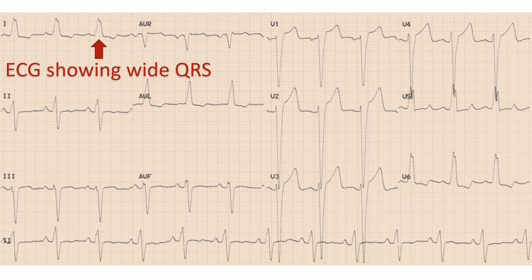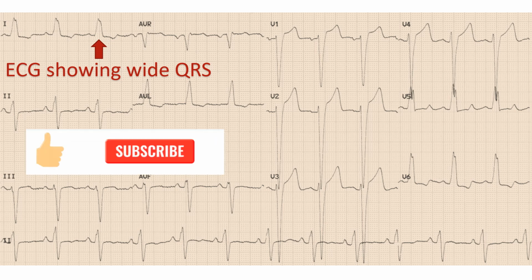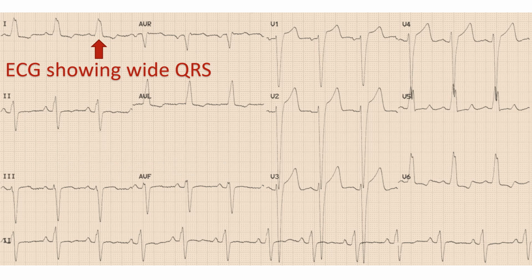In some persons with heart failure and reduced ejection fraction, contraction of different parts of the left ventricle loses its natural synchrony, so that part of the contractile effort is wasted. This can be inferred from ECG, the electrical recording of the heart. ECG will show a wide QRS complex with a left bundle branch block pattern, LBBB, in those with dyssynchrony. QRS complex denotes the electrical activation of the lower chambers of the heart. Left bundle branch is that part of the electrical conduction system of the heart which takes signals to the left ventricle.